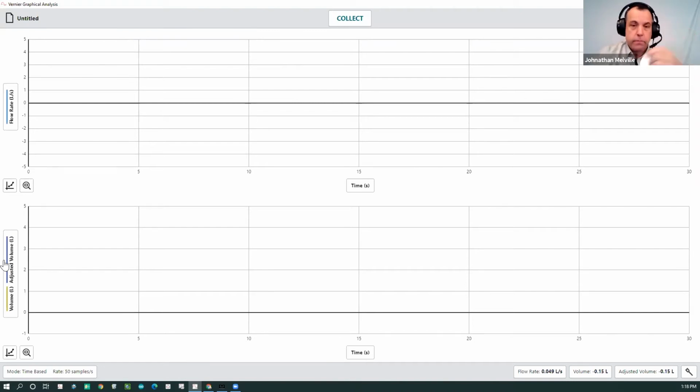The other really important thing to be aware of is both of these spirometers have something on them that says inlet. Inlet. That's the side you breathe on. So the bacterial filter wants to go on the side that says inlet. Same thing here where it says inlet. It's nice and snug. And then I'm going to put the little mouthpiece on here.